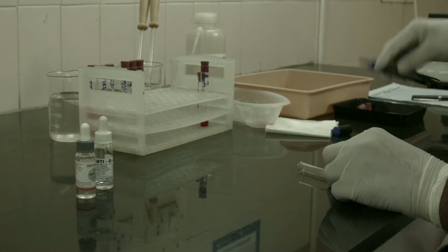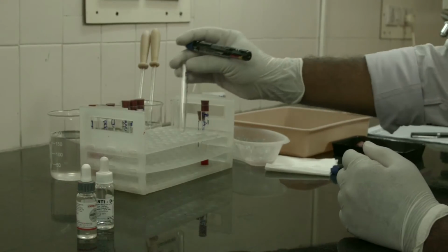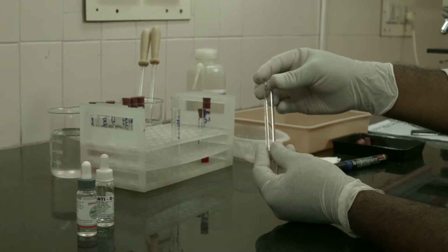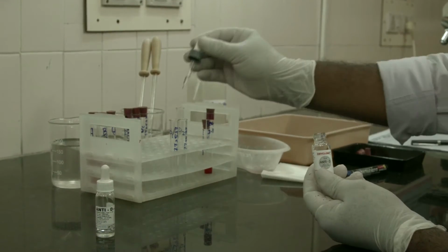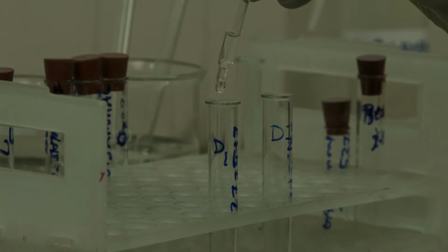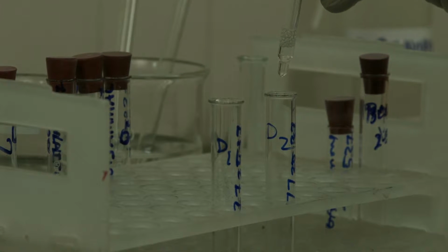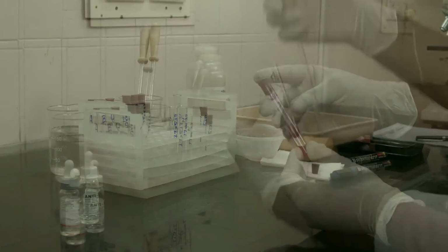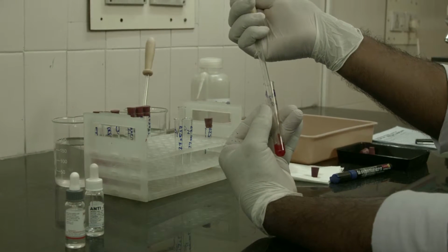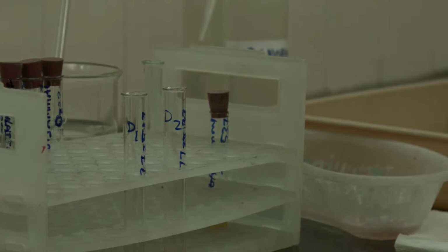For RHD typing, we use 2 reagent antisera, namely IgM D1 and a blend of IgM and IgG, D2. Label 2 test tubes D1 and D2. Add 2 drops of anti-D1 and anti-D2 in each of the labeled test tubes. Prepare 2 to 5% washed cell suspension of test sample as described previously. Add 1 drop of the 2 to 5% cell suspension in each of the labeled tubes.